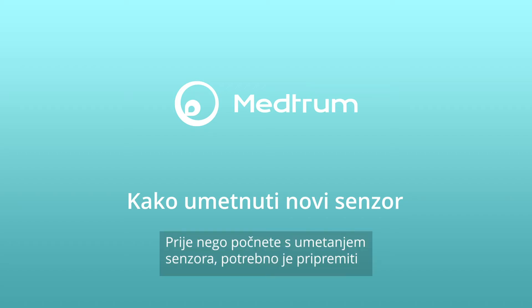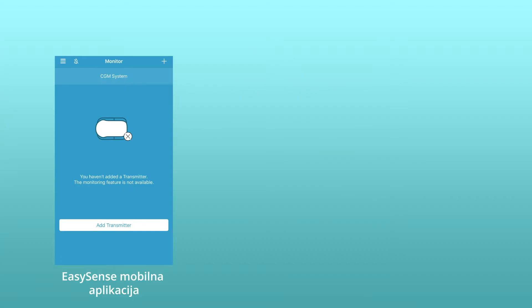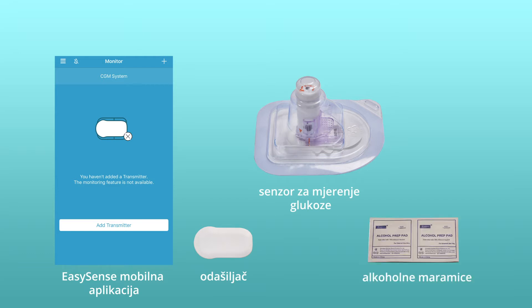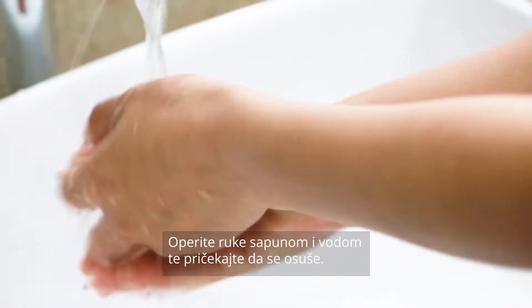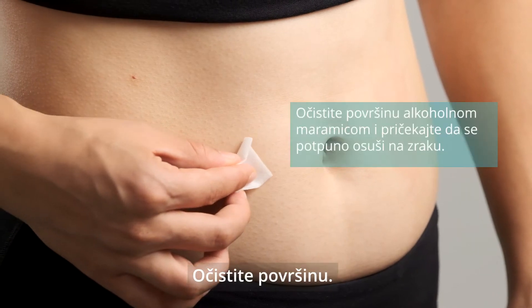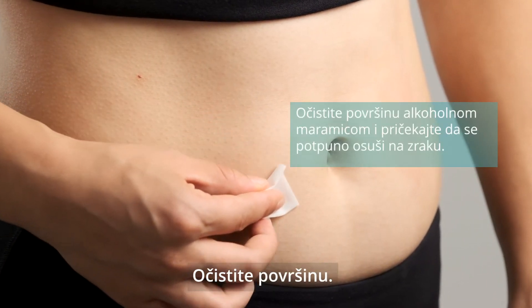Before you start inserting a sensor, you need to prepare the Medtrum EasySense mobile application, a transmitter, a glucose sensor, and alcohol wipes. Wash your hands with soap and water and wait until they dry. Now choose a flat and pinchable placement site. Clean it with an alcohol wipe and let it air dry completely.